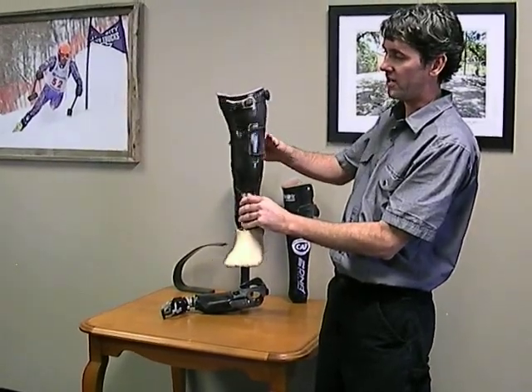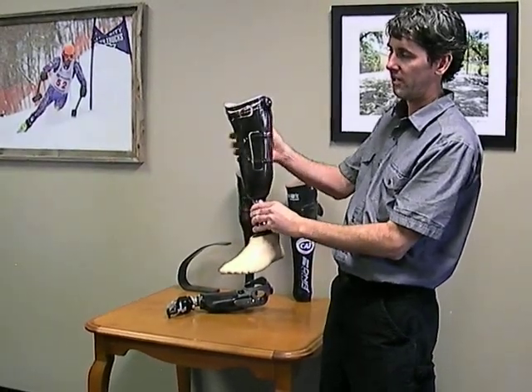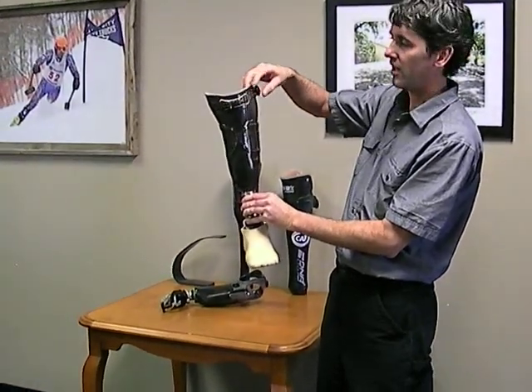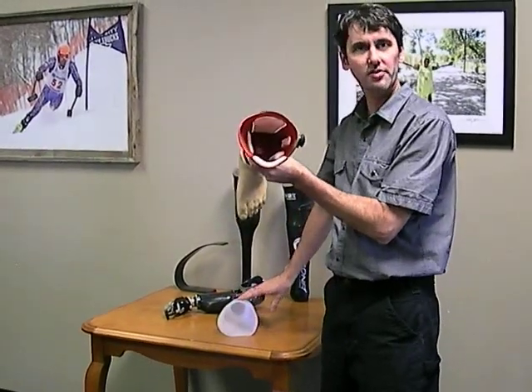This zone down here has four pads all the way around. The top zone has three pads that articulate on the tendon for a custom fit. Inside looks like that.